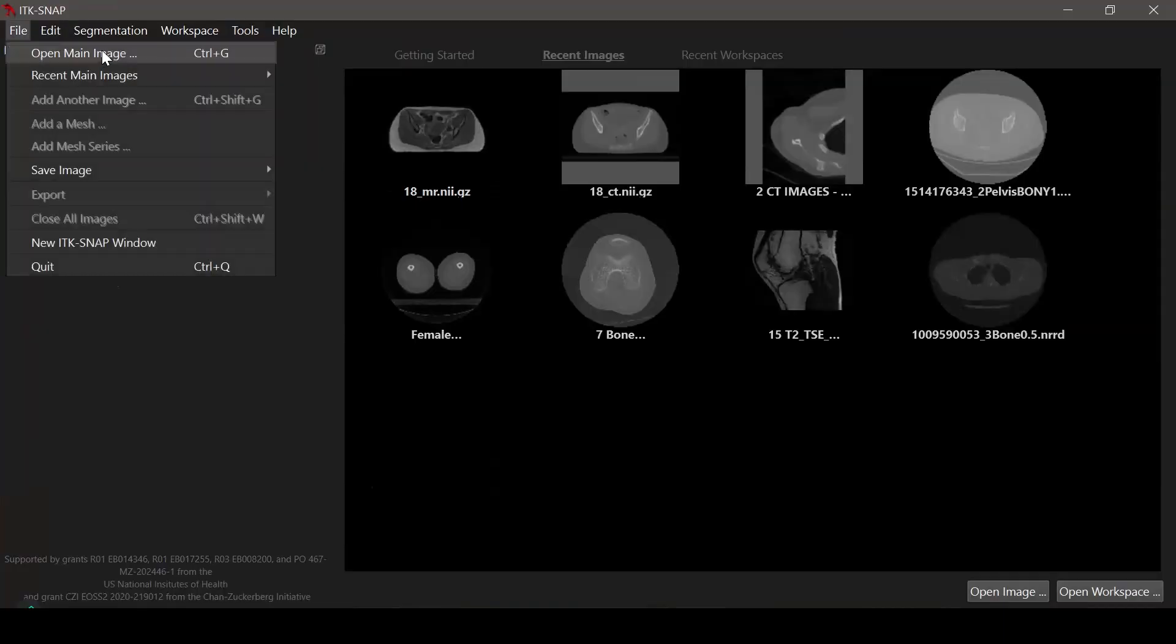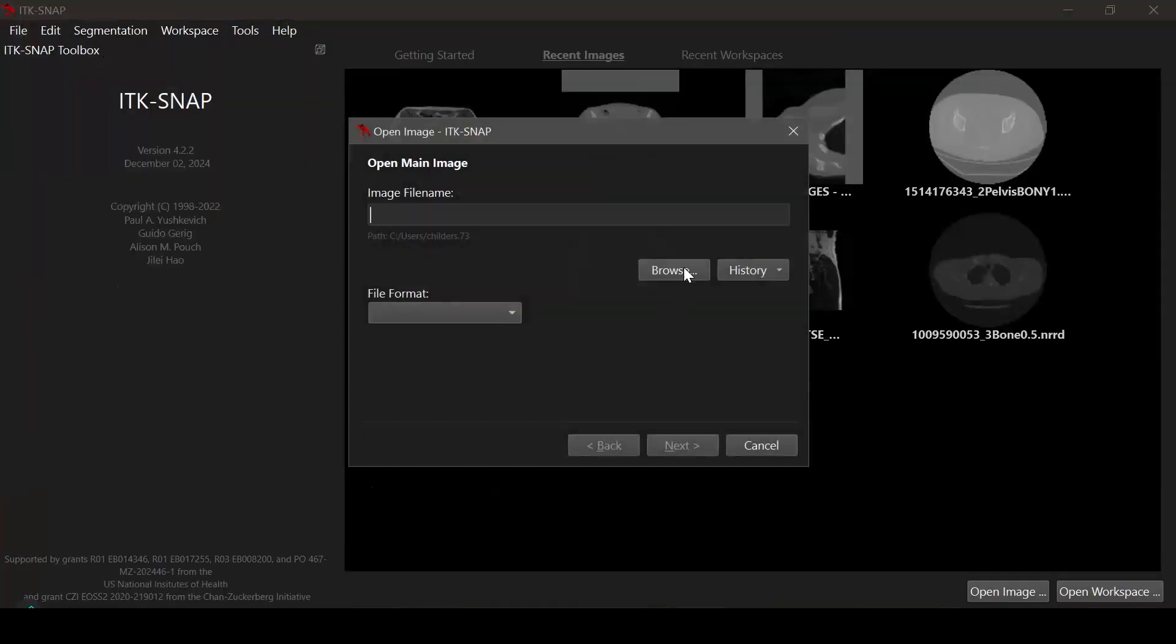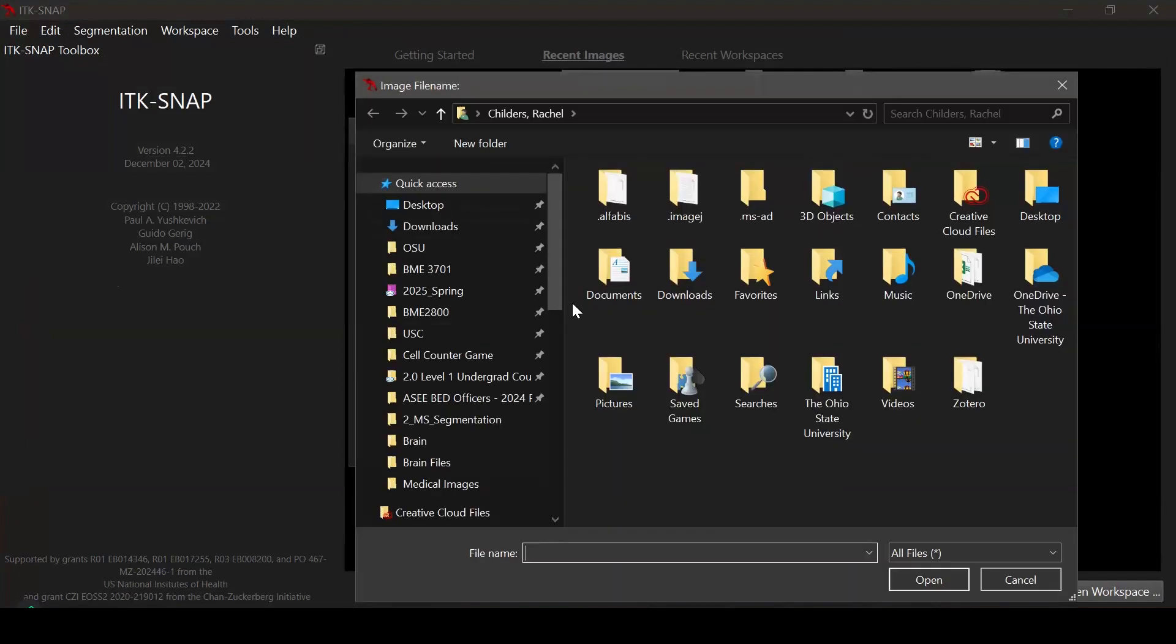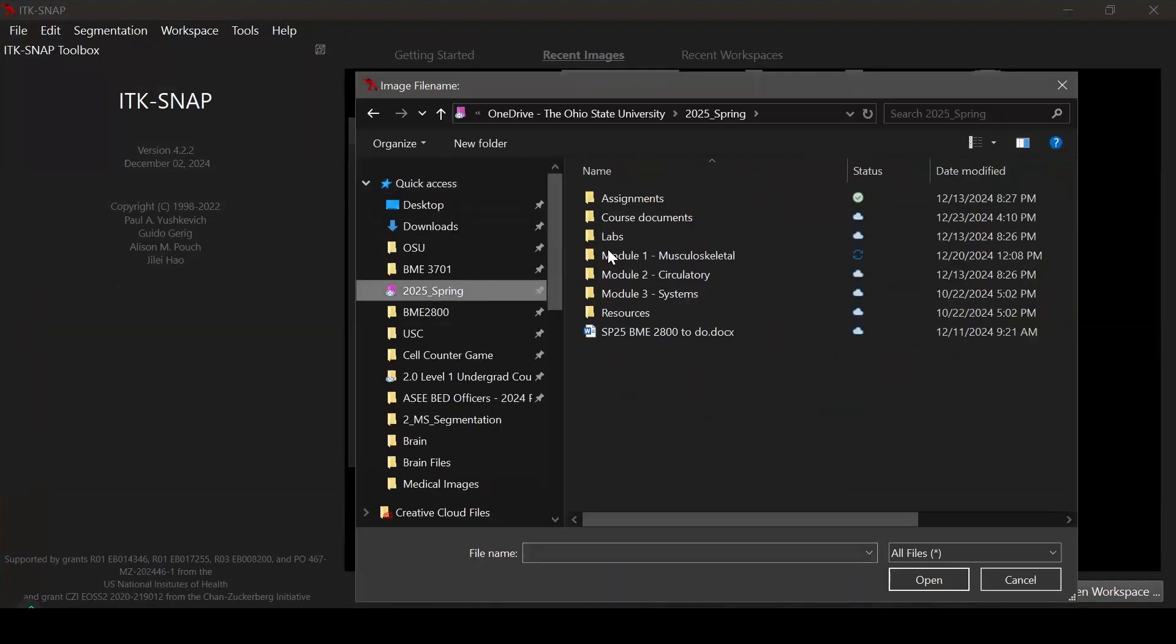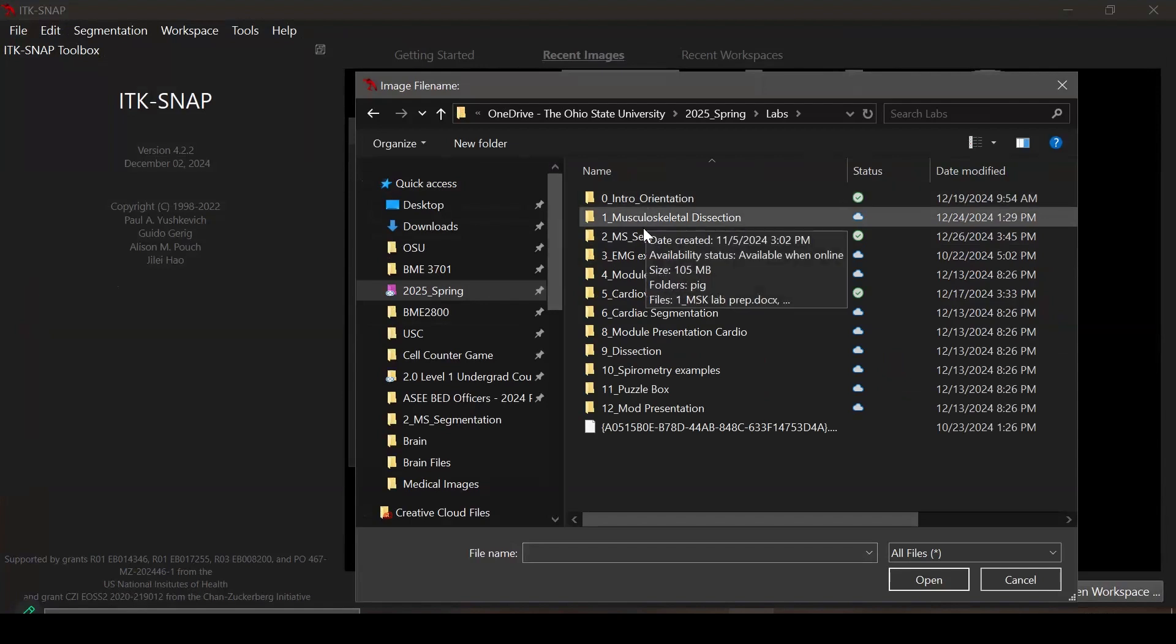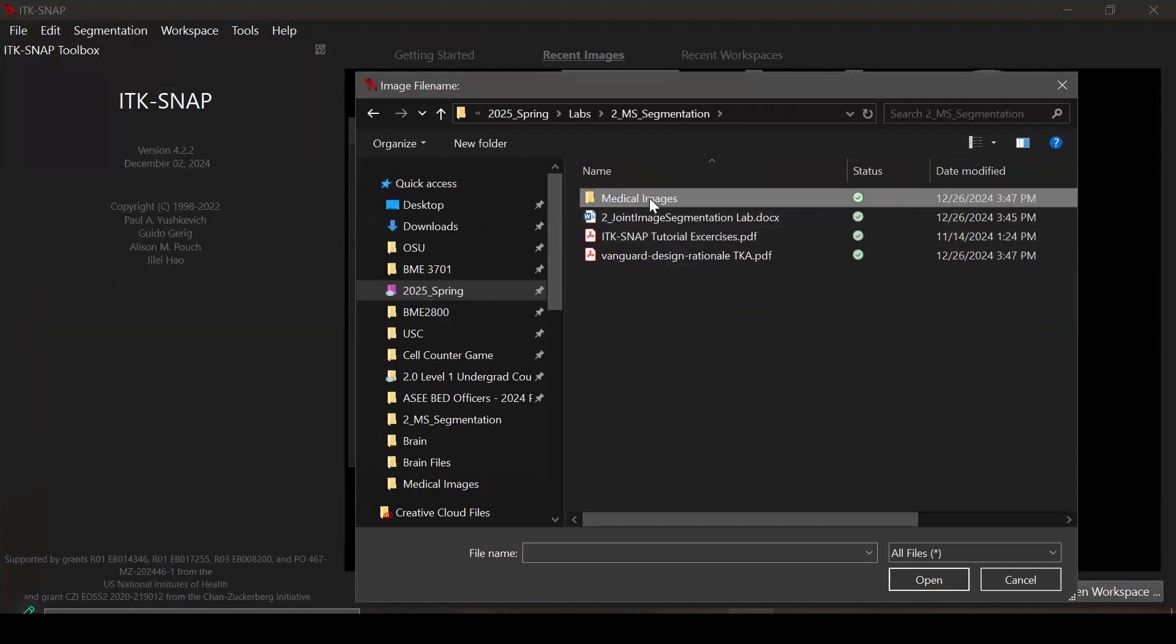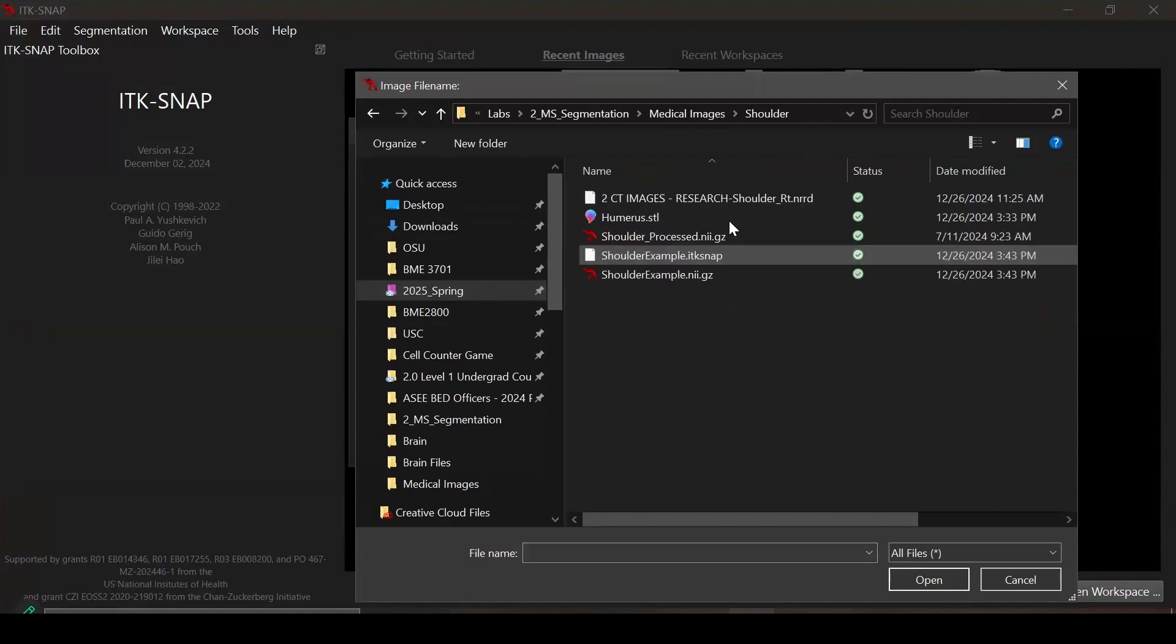The first step will be to load the image slices into the software called ITK-SNAP. This is a free software that's downloaded onto the lab computers. Browse to the folder location where you've already downloaded your file that you plan to analyze, select the file, and load it in.